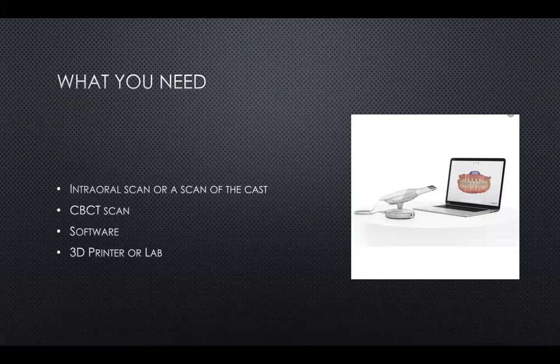The other thing that you need is a CT scan. Again, it's a standard of care now for implant treatment planning. You need a software, and you need a 3D printer, or again, you don't have to have it in your office. You can just have a lab that has a 3D printer. And most of the labs right now do have 3D printers, and they do have scanners in general that can enable them to scan your cast.